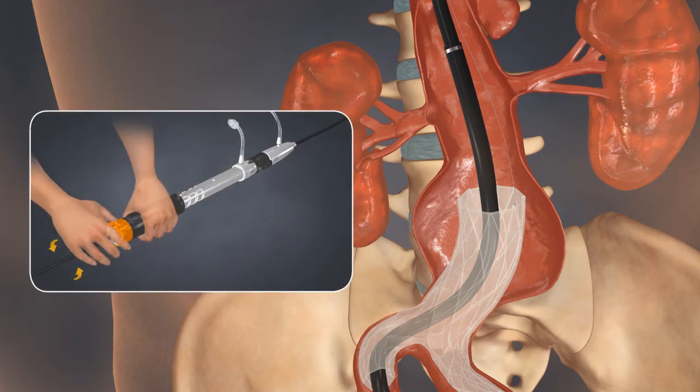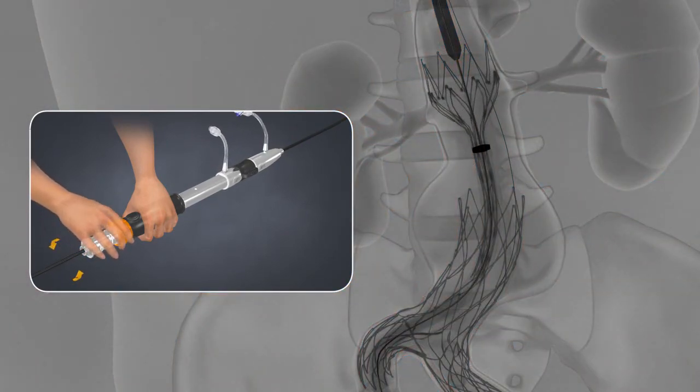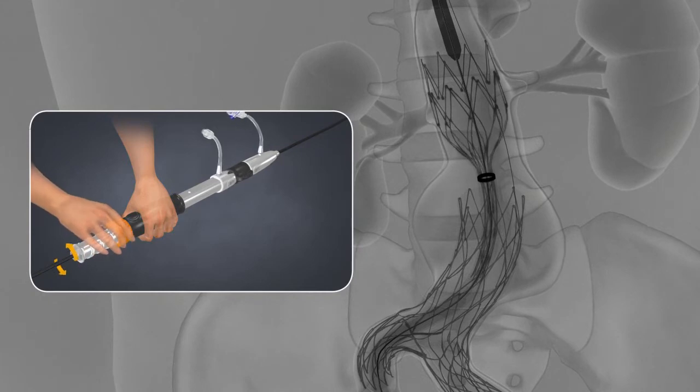To begin deployment, pin the delivery system handle and rotate the dial counterclockwise. Continue rotating the dial until the first covered stent segment is opposed against the aortic wall.